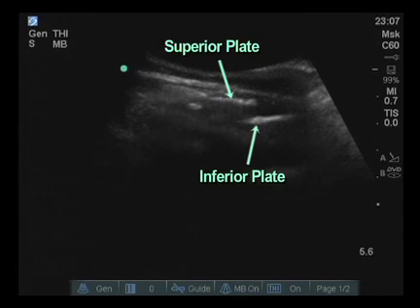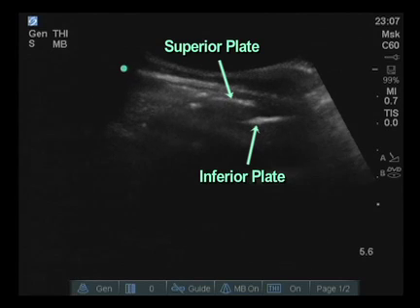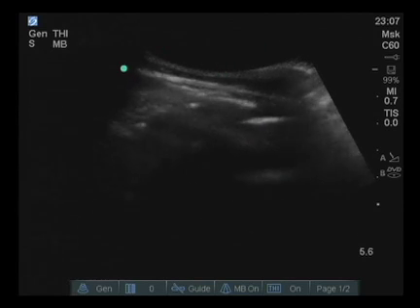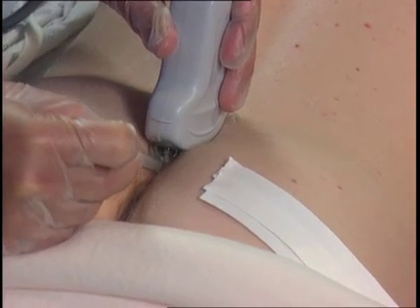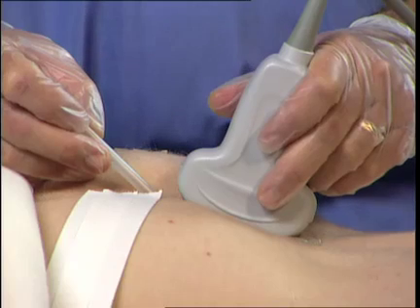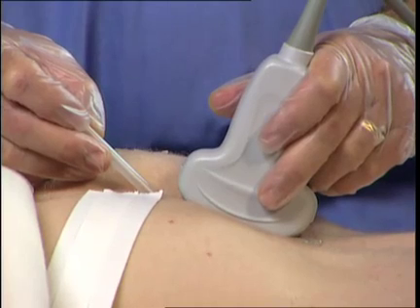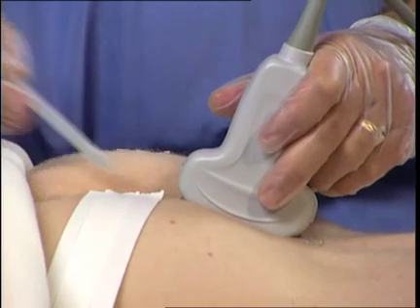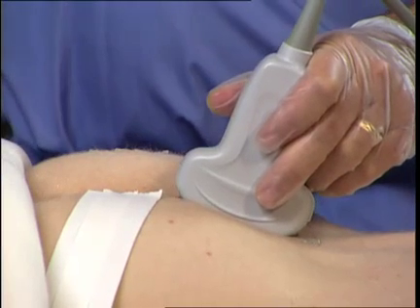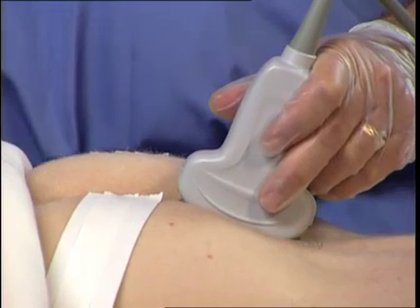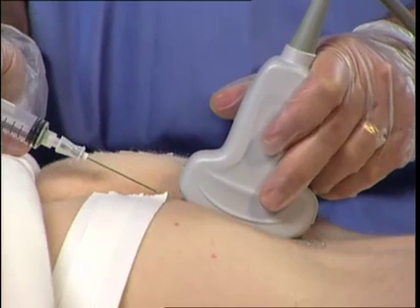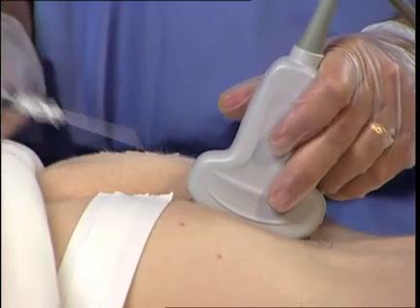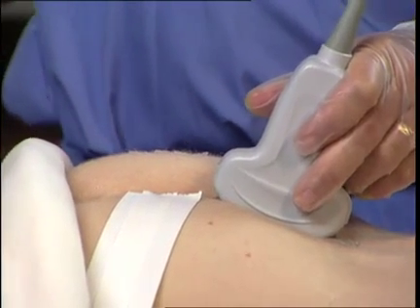There is a superior plate and an inferior plate, and in between them is the sacral hiatus. I'll demonstrate where that access point is. The needle is angled thusly. At this point, I would utilize the local anesthetic to perform a local anesthetic track down to this level, then remove that needle.